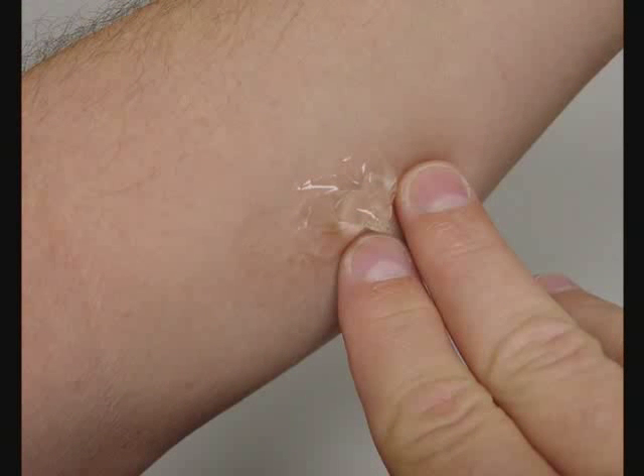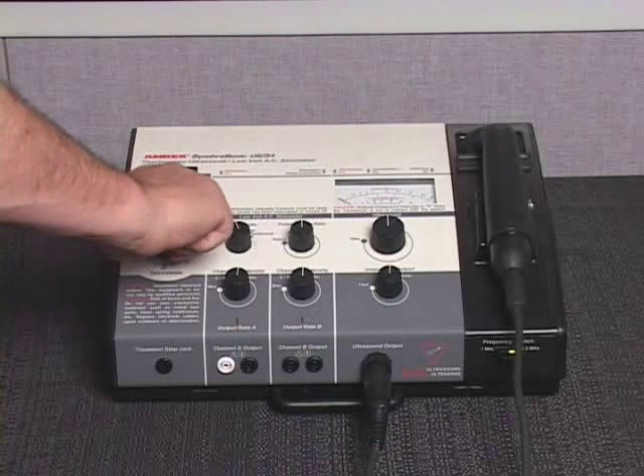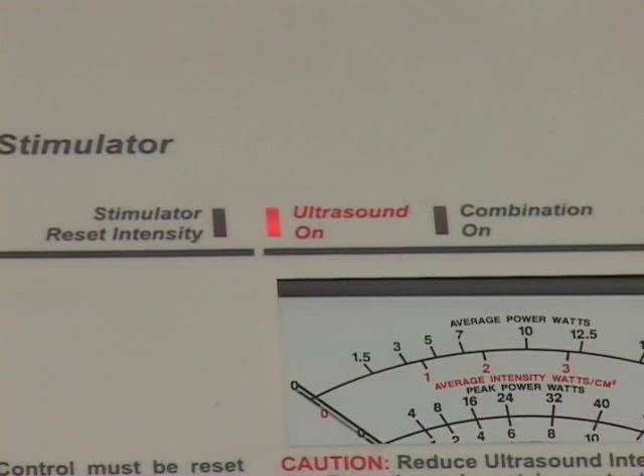Prepare a contact medium at and around the treatment site with a liberal coating of AMREX conductance and coupling gel. Rotate the power timer knob and set it to the desired treatment duration. The ultrasound on indicator light, located above the upper left corner of the ultrasound meter, will illuminate.